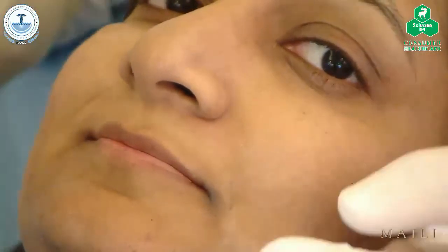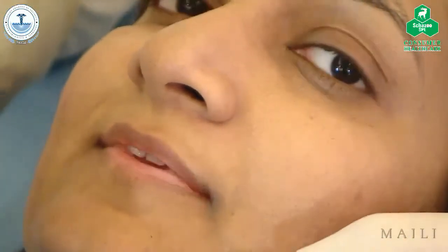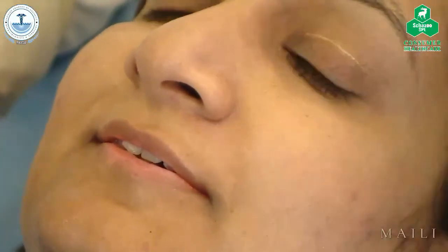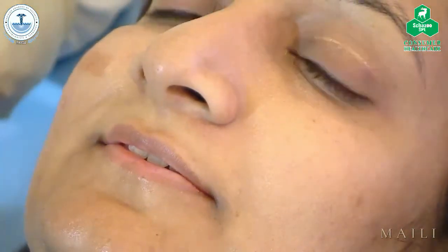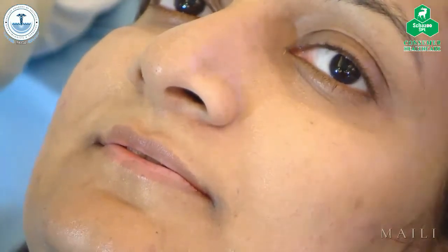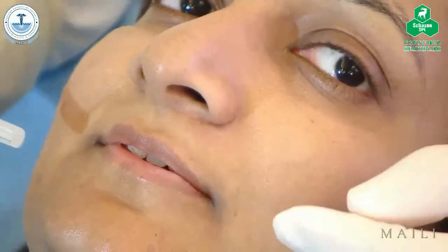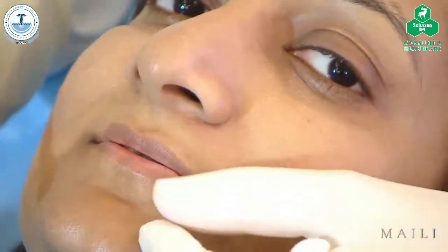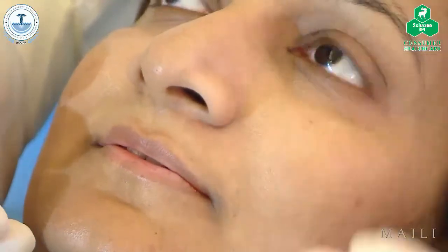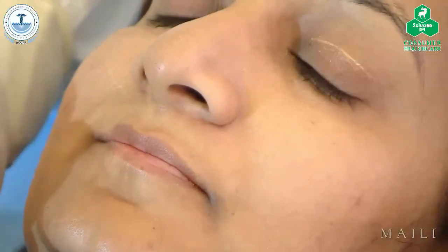You can see the lips are quite thin. There's very little philtrum, and the upper lip is very short. When you have a short upper lip, the white lip, we have to be very careful what we do, because if we evert it too much, it will look like it's touching the nose, and if it doesn't evert as much, it can actually project, and it looks very strange and stiff. The mouth is wider, and I think she can definitely benefit more from eversion than anything else. So there are different ways of getting it.